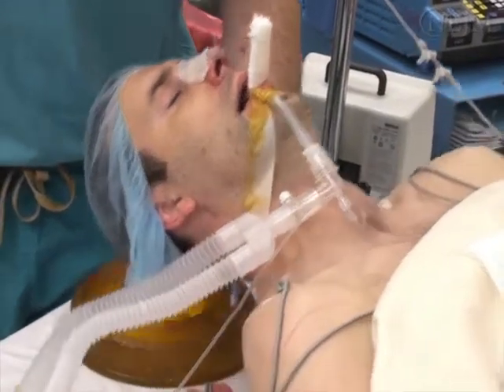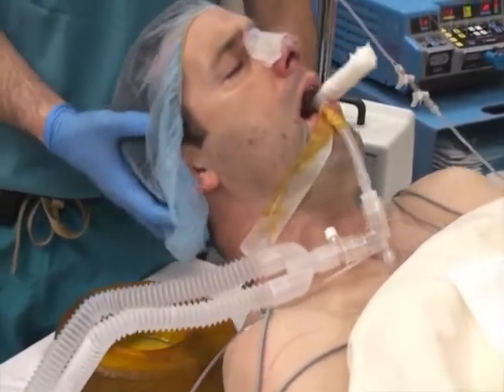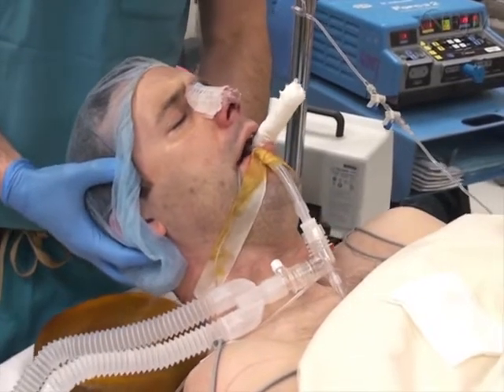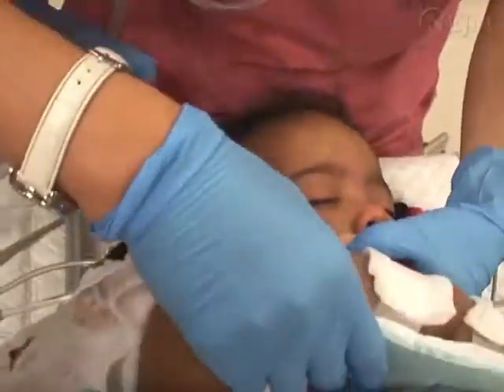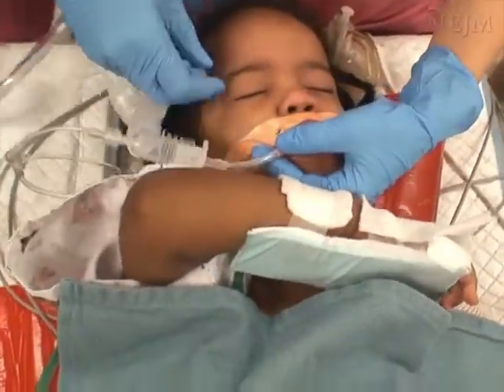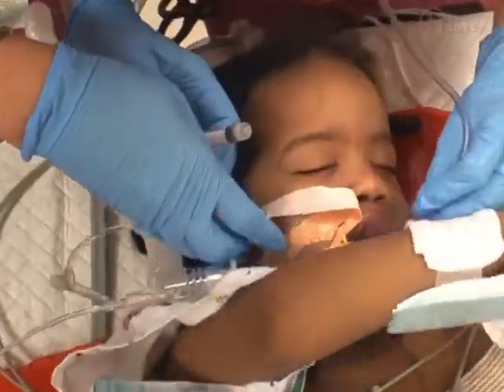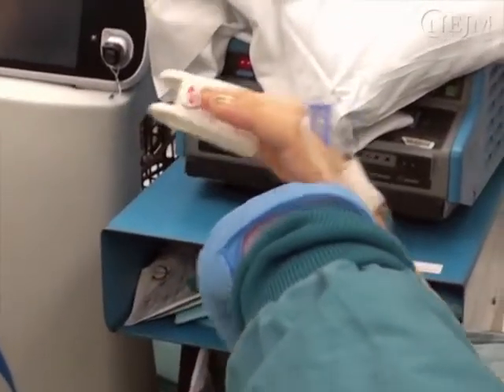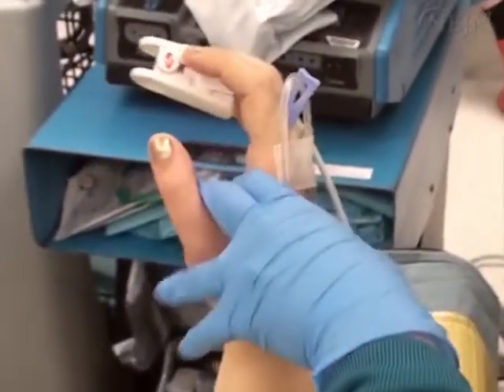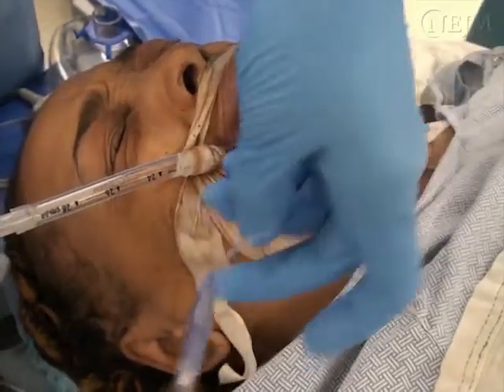Patients emerging from general anesthesia often make forceful, uncoordinated movements just before they are ready for extubation. Therefore, it is vital to protect the position of the endotracheal tube to keep the patient from accidentally self-extubating, which could cause hypoxemia. In addition, the patient's fingernails or objects such as the pulse oximeter could cause abrasions to his or her corneas if the arms and hands are not secured.